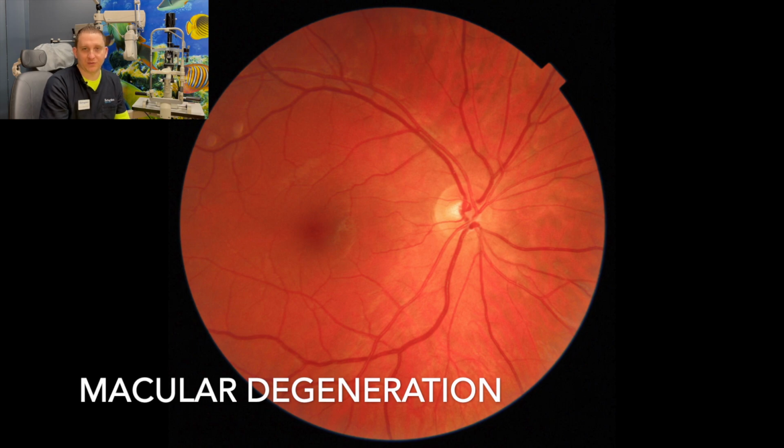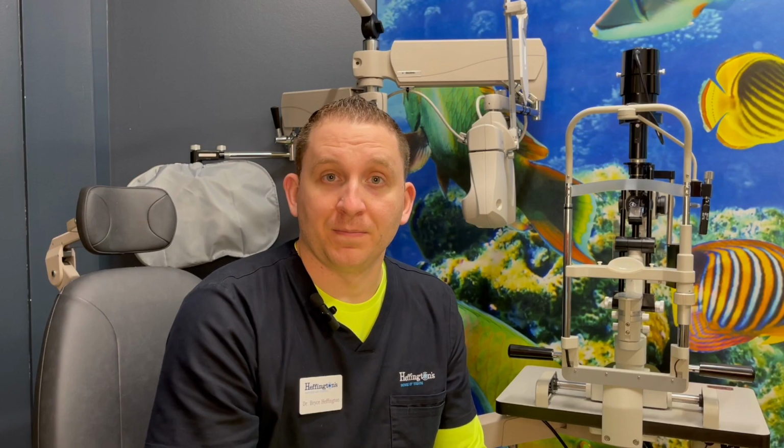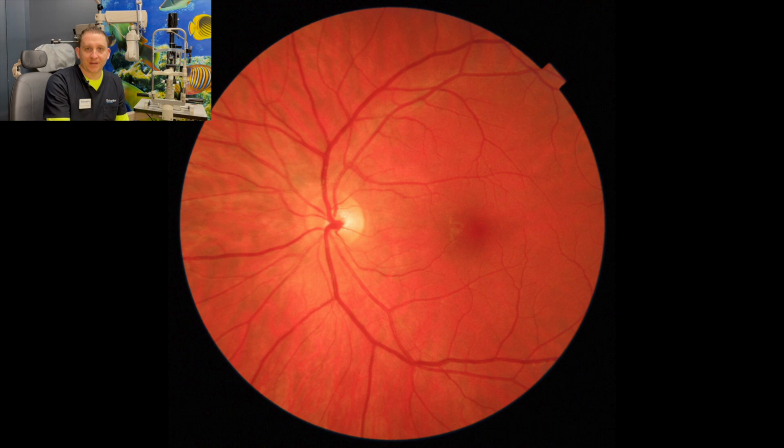And the optic nerve is where we watch for glaucoma changes. That's what my right retina looks like. Now I'm going to show you what the left retina looks like. It's almost going to look like a reversed mirror image. So now you're going to see the left retina, and you'll see the same structures and same anatomical features, it's just in a different position opposite of the right retina.